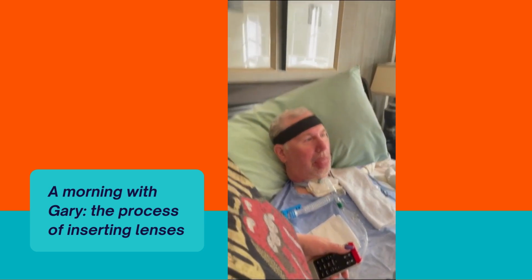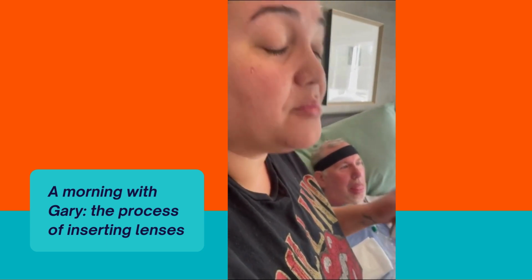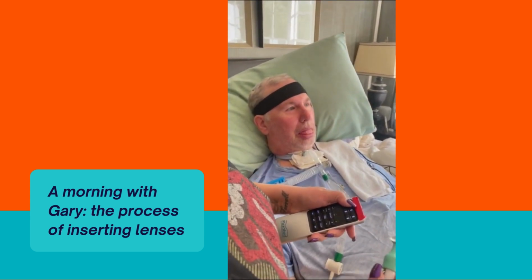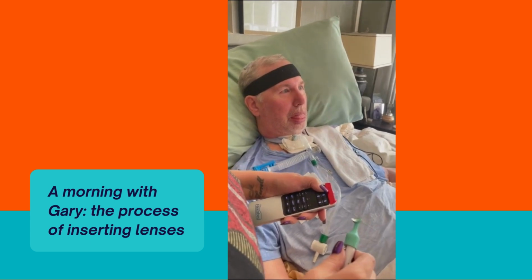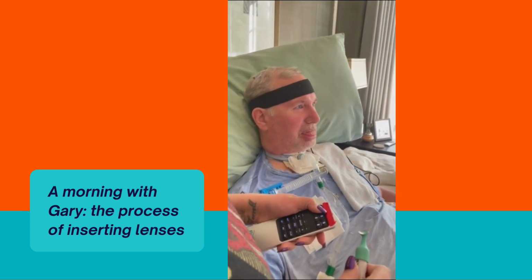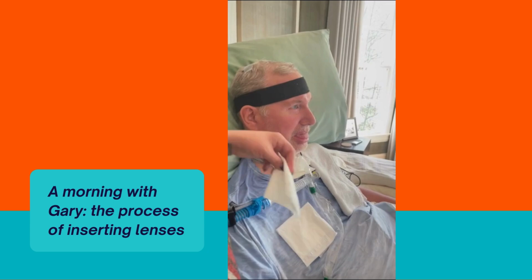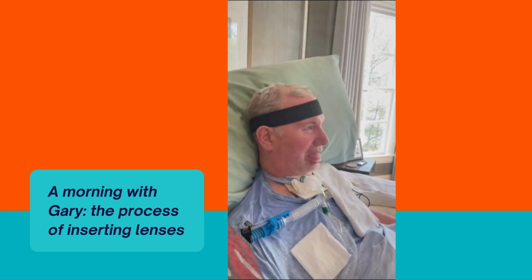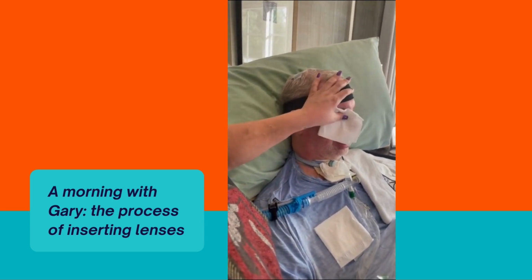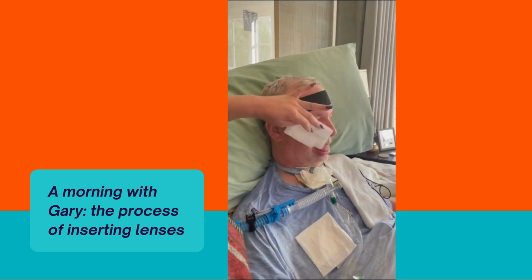But what's the biggest key? The biggest key is sitting Gary as straight up as possible. Not so much leaning forward or hunched over, but sitting as straight up as he can take, and that makes it easier to slip the contact in. So we have an automatic bed, but if you don't have that, you can do this in his power chair or someplace else. But you're getting him really vertical. You can see how vertical Gary's getting. So now he's basically sitting straight up, and we're going to wipe with the contact because we flush Gary's eyes just to get any sleep in, the morning salt as Carol calls it, out of his eyes. So we're just going to make sure that area is dry.